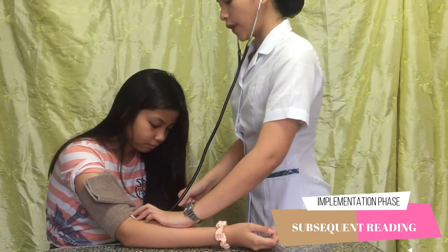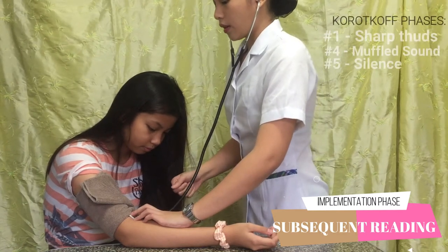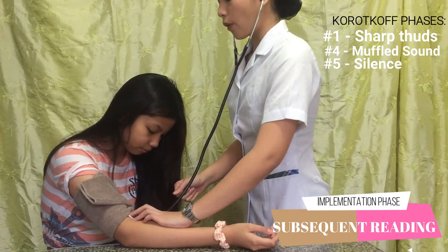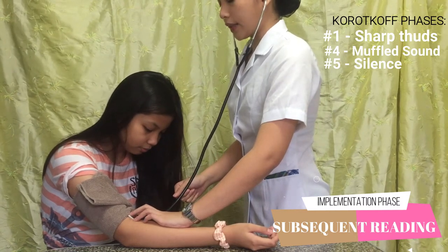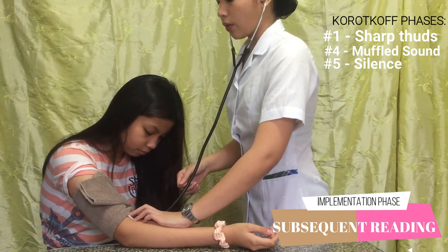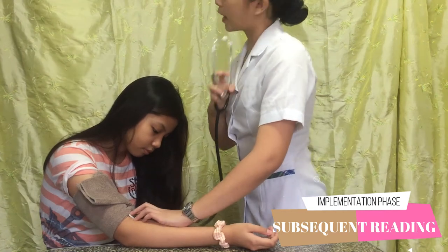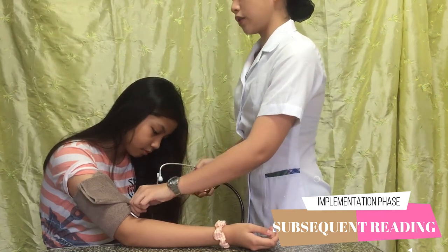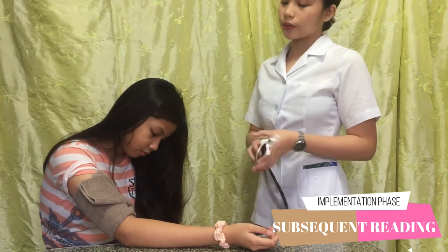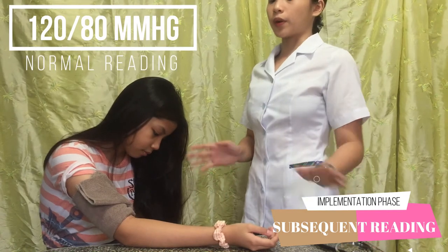The first phase of Korotkoff sounds is sharp thud sounds. And then we are going to start to deflate. The fourth phase is muffled sound. And the fifth phase is silence or the end of the sound. That is when we deflate it and there is no more sound. That is the fifth phase of the Korotkoff sound. So the reading is 120 over 80, which is perfectly normal.